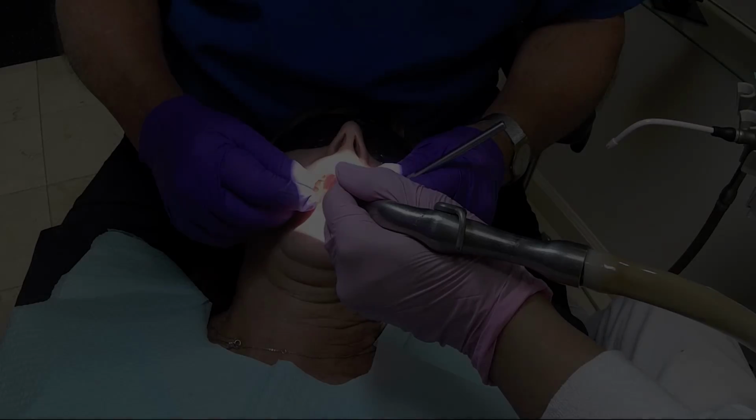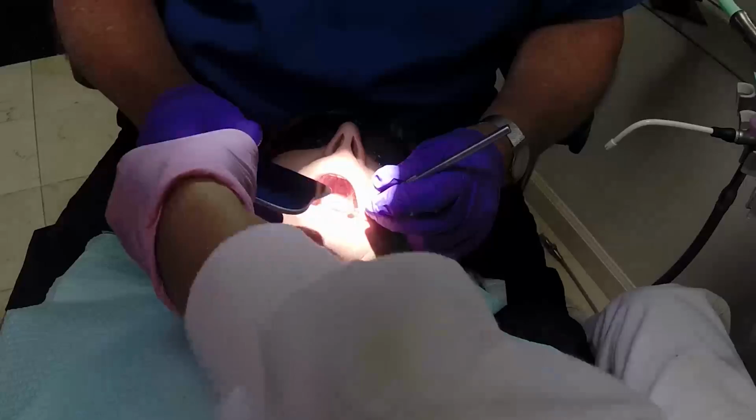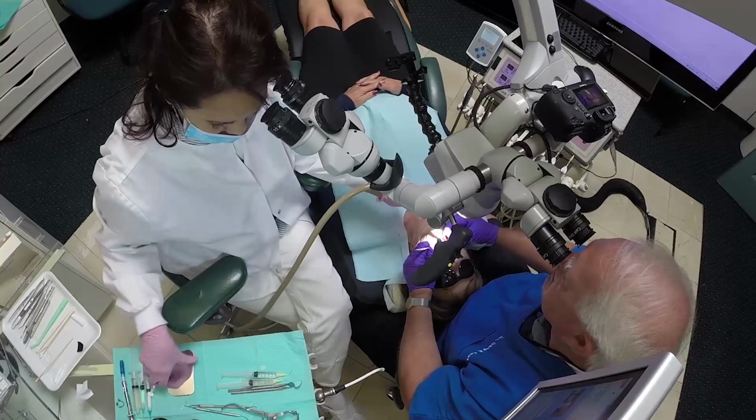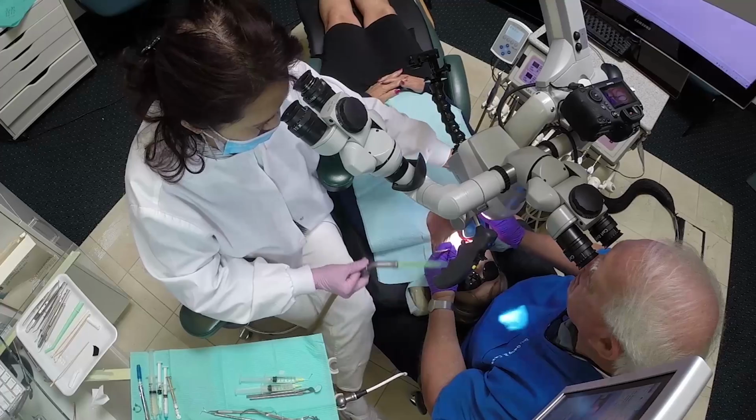We're going to be looking at some ergonomics of documentation through the microscope. We're going to look at this in real time, first of all, and then take the procedure apart in small steps. So we're trying to get a picture of this leukoplakia on a patient's palate. And this is the process in real time as we do this.